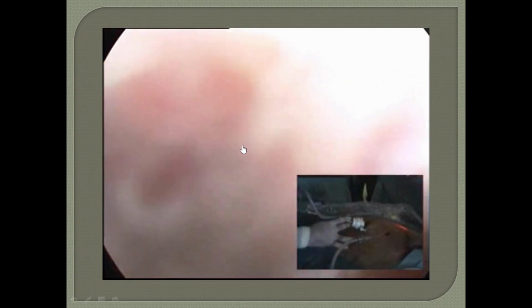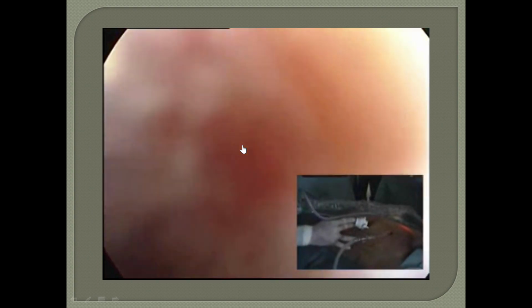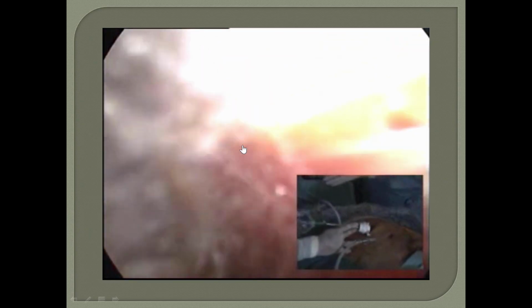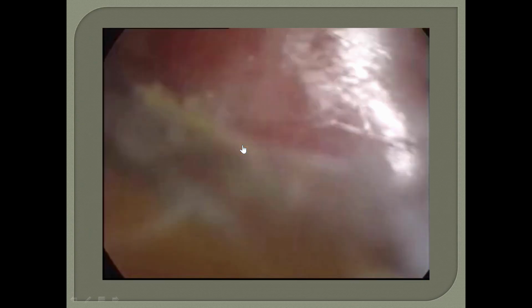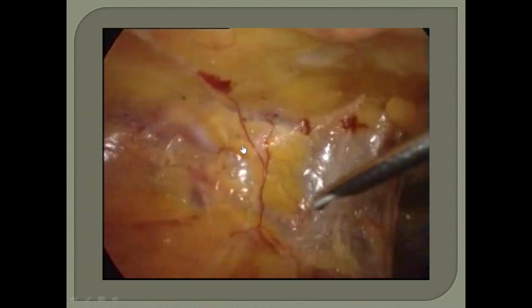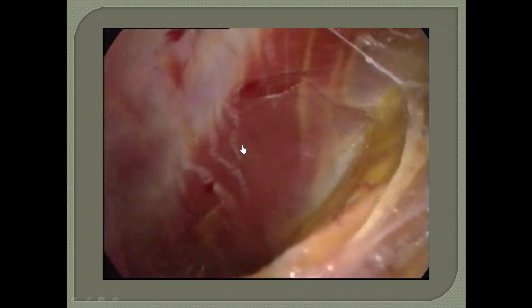First, to place the prostate at the end of the surgery, and also to have the possibility of suction, because then it won't collapse the space. So you see, it's done now, and you do exactly the same on the opposite side, and then it's done.